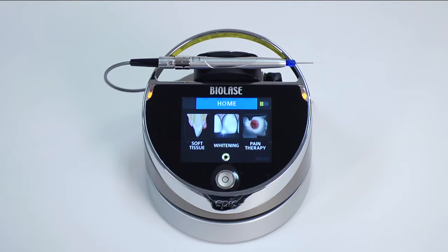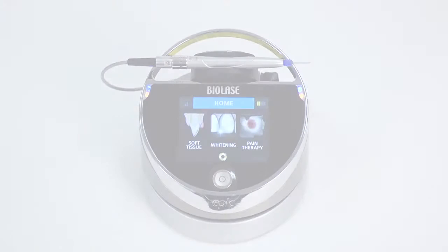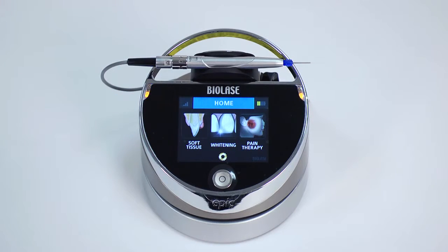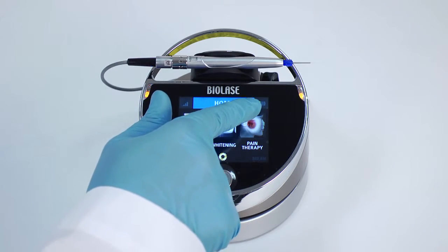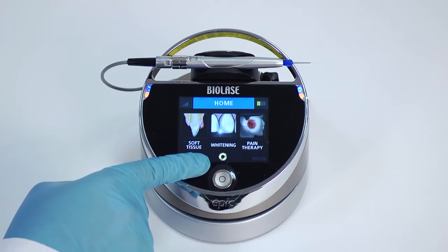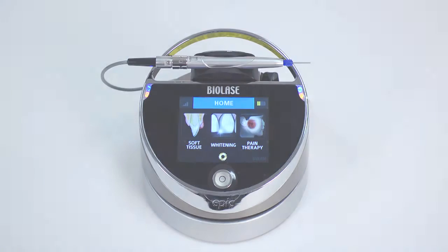Before proceeding, become familiar with several important elements on your EPIC home screen. The wireless signal strength indicator in the upper left corner indicates the wireless signal between your EPIC laser and its foot switch. You will also see the laser console battery strength indicator in the upper right corner, which indicates the remaining battery life for your EPIC system.